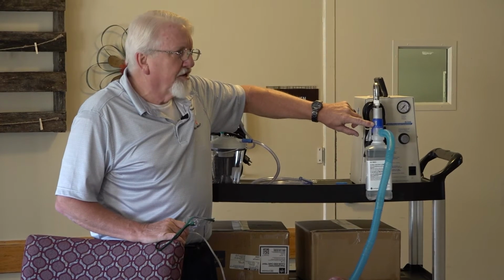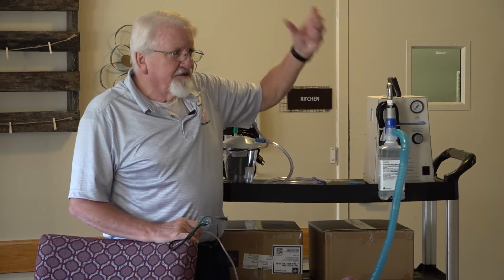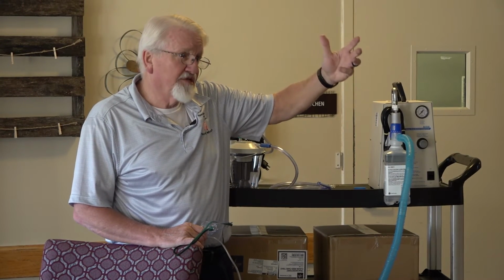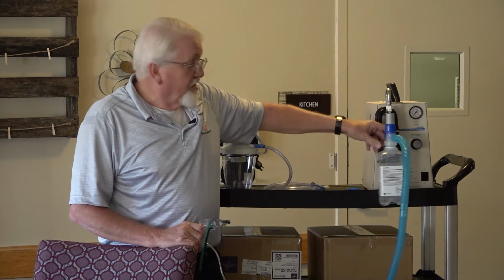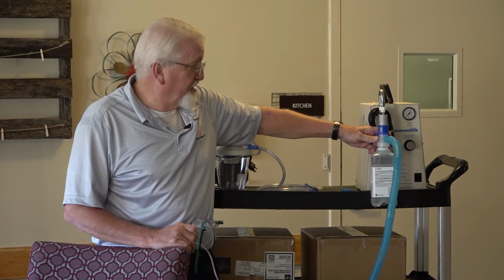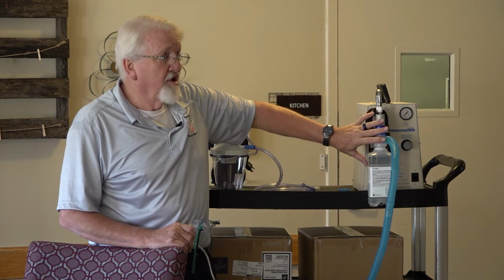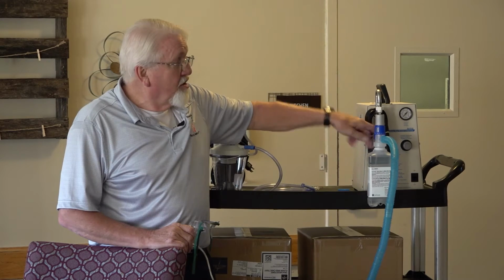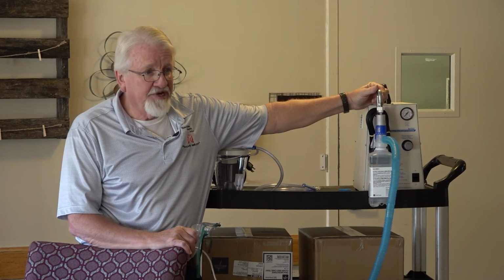This dial up here is actually designed to be used on a system, oxygen system in the hospital, and is used as a Venturi to control the amount of FiO2 we're trying to give that patient, okay? That's typically what this is used for in a hospital setting. In this setting, we're actually using it to control the amount of humidity we're providing the patient.